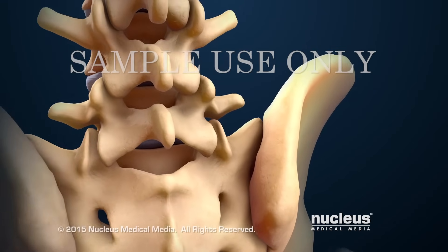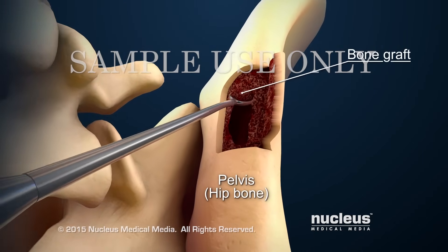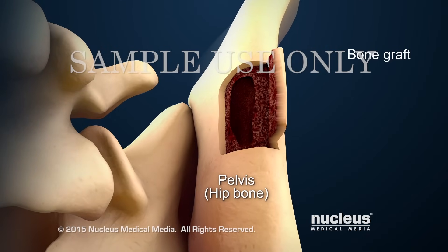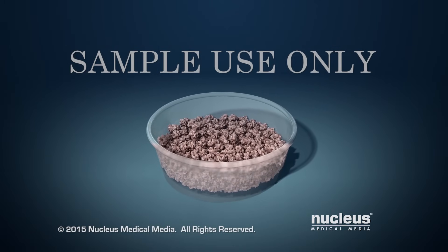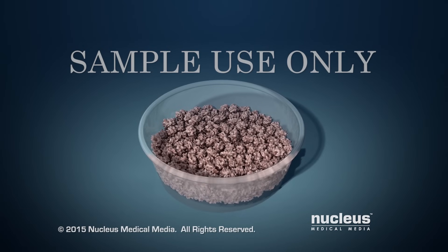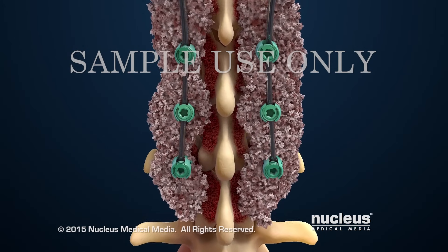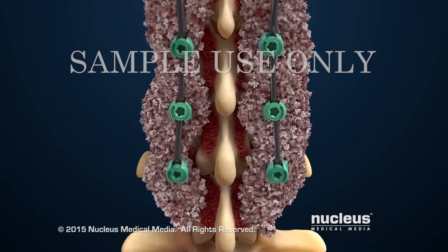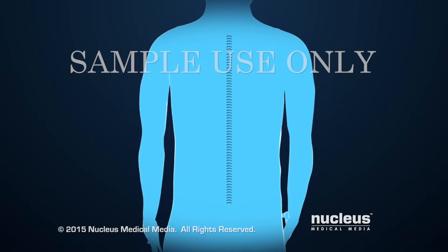The surgeon may remove small pieces of bone from the ribs or hip bone to use as bone grafts. Other times, the surgeon may choose to use donor bone from a bone bank for grafting. The surgeon will place the bone grafts along the spine to allow the vertebrae to grow together and keep the spine stable. At the end of the procedure, the skin incision will be closed with stitches.